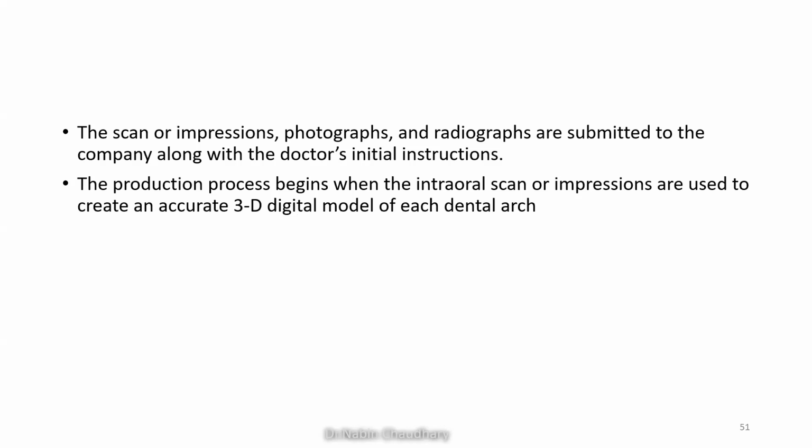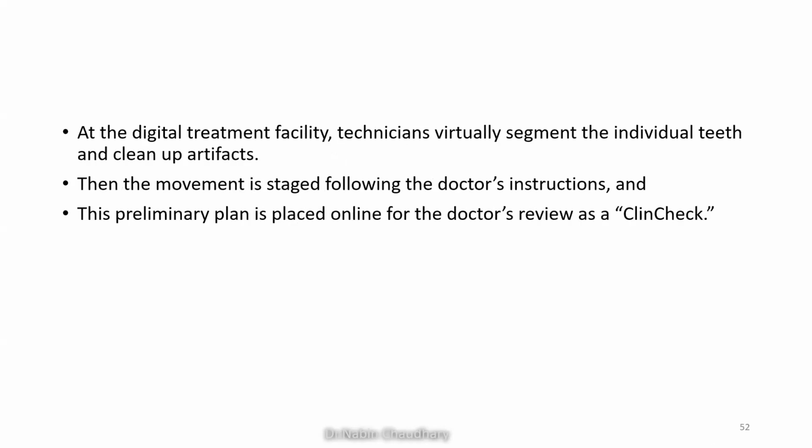All the impressions are generally used to create a 3D scan digital model of each dental arch. At the company's digital treatment facility, the technician will segment the individual teeth and clean up the artifacts, and then the technician will move the teeth, with the movement staged following the doctor's prescription. This staging in ClinCheck will be reviewed by the doctor.